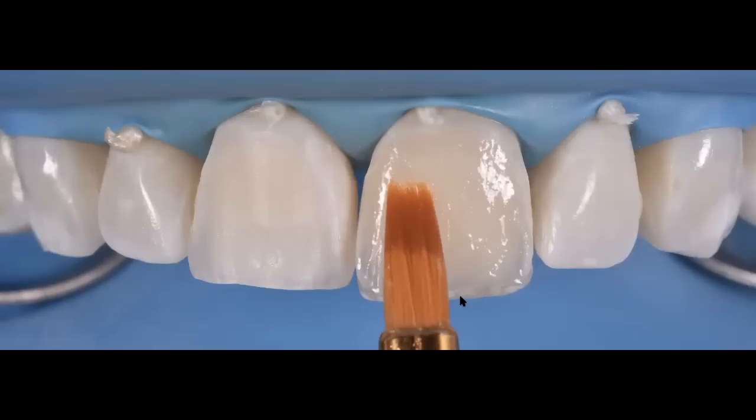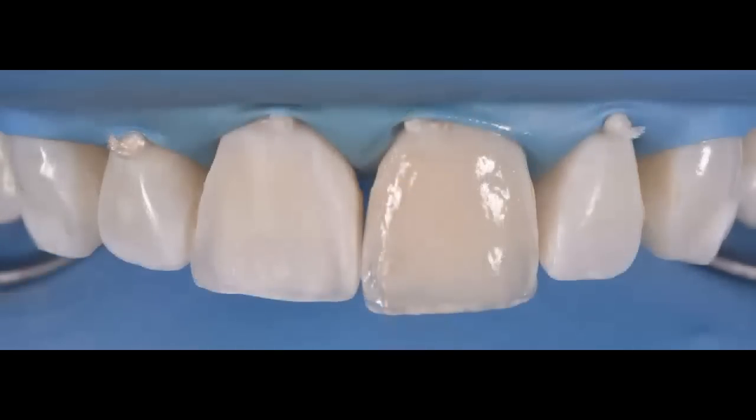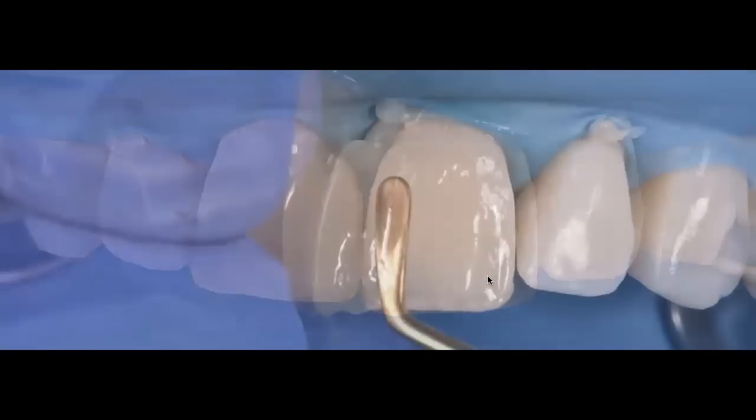And the other reason why I like using these brushes is because I can get some texture built into that composite layer. When I add my enamel layer and the light goes through the enamel, this dentin with a little bit of texture will break the light just like natural dentin would do with light. So once I apply my dentin, you can see it was a very thin layer of dentin. I'm ready to start building now my enamel layers.